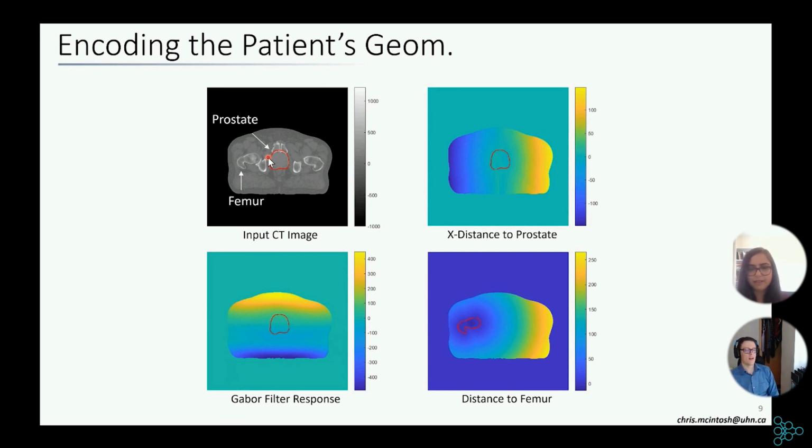The regulatory pathway, how it basically worked is we created the technology, we patented it, we licensed it to the company, and we built a version of the technology with the company. Then, one more step, we trained the models with the company on the data set. We verified that those models worked in the same way that the machine learning models I had built at the hospital worked. We then submitted that data with the company to the FDA, and it went forward for approval that way.